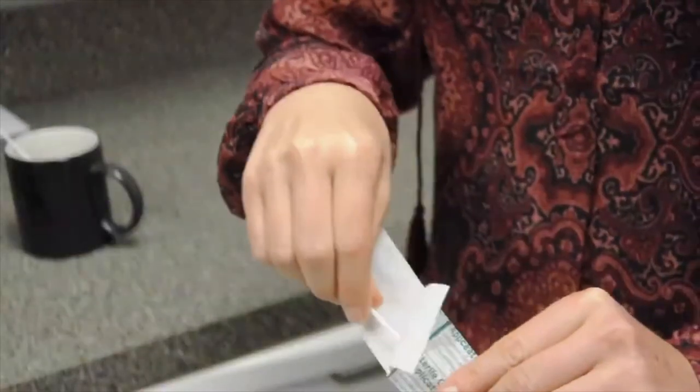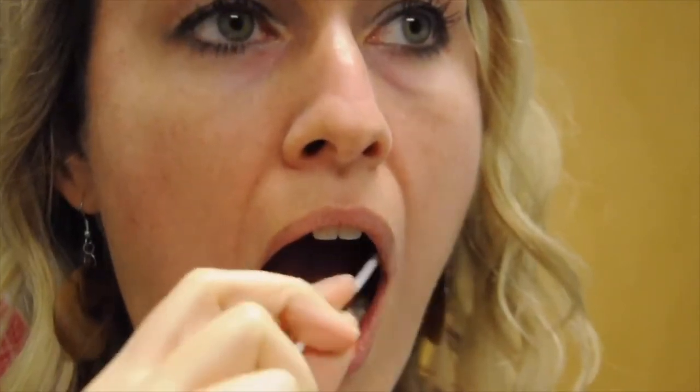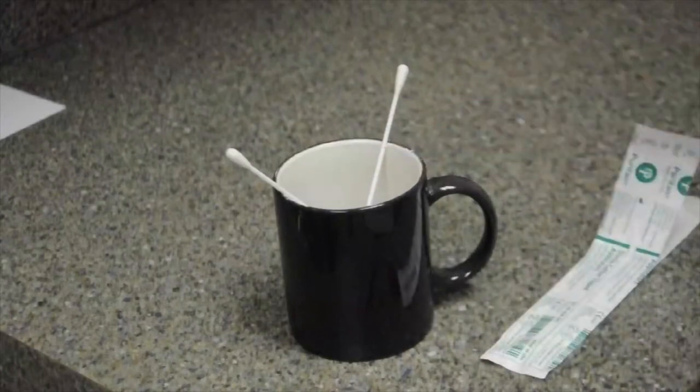Next, remove the second swab from the package and repeat the same 30-second collection steps on the opposite cheek — back and forth, up and down on the inside of the cheek. Rotate several times. Swab between the cheek and gums.